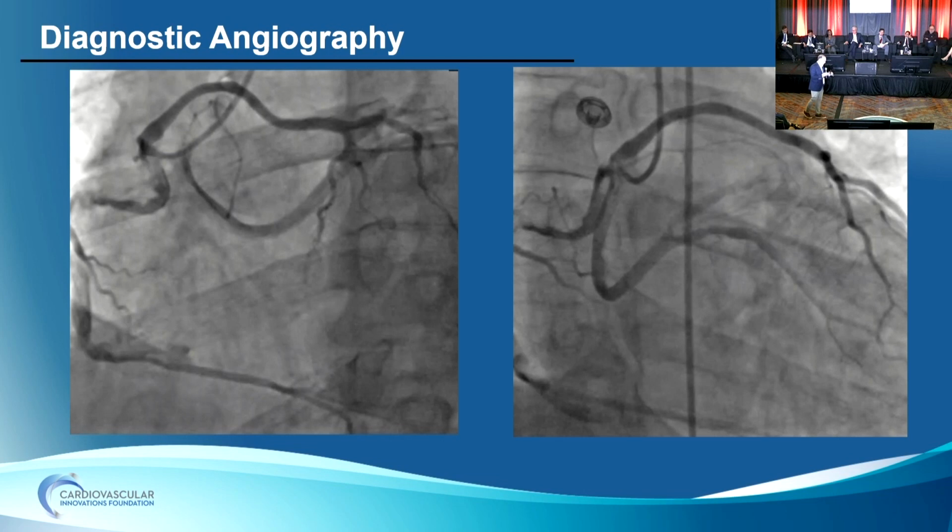But I just want you to recall as well that he's less than 2 weeks out from major abdominal surgery, right? A small dose of intracoronary thrombolytics might not be a big risk, but we still don't know what the cause of this is, right? I mean, there's no atheroma, just a massive volume of thrombus. I just want to go back to Manos's point. If we get flow down with a balloon, that might be all you need, and then you start thinking about what the heck is going on and maybe engage surgery.